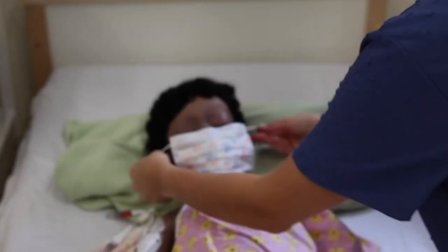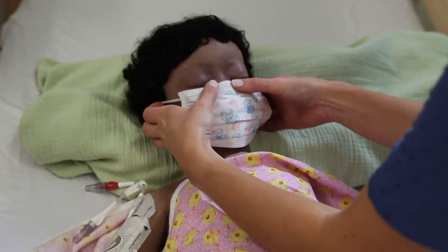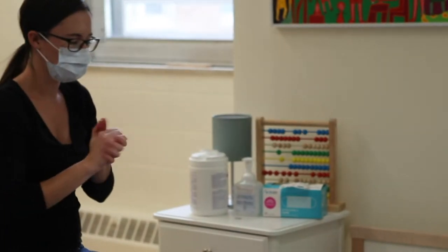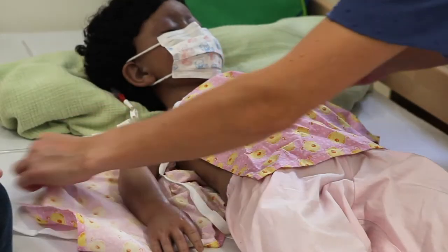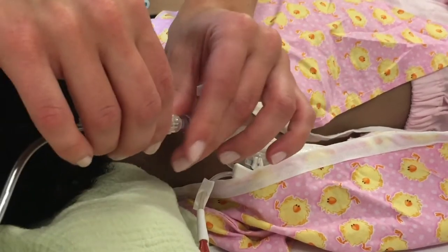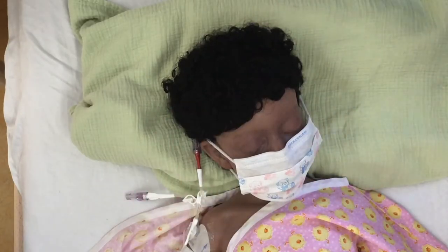If your child is too young or unable to wear a mask, have the second person support them in turning their head away from the CVAD. Perform hand hygiene after touching your face. Make sure your child's clothing will not get in the way of the procedure. Clamp the line of the CVAD and remove and discard the old tubing if currently connected.